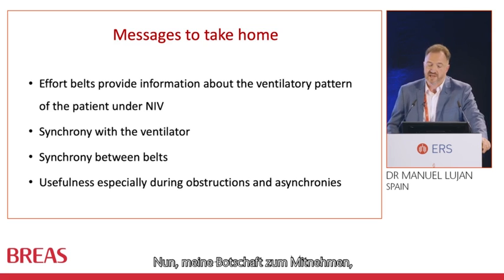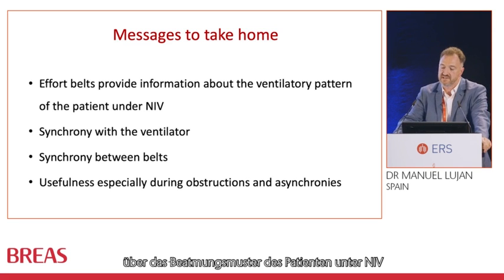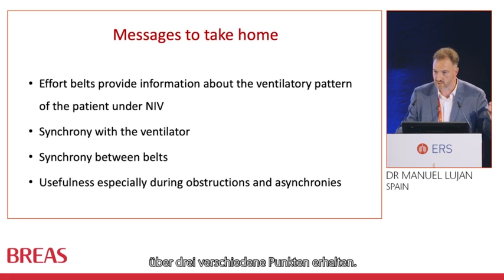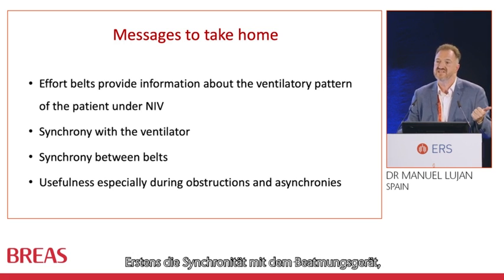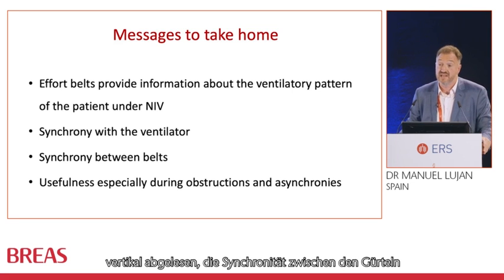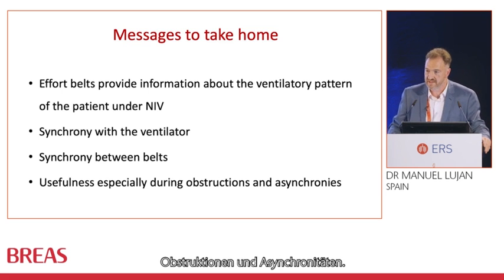Well, my take-home message: effort belts provide information about the ventilatory pattern of the patient under NIV, and we can get information in 3 different points. First, the synchrony with the ventilator, reading in vertical. Second, the synchrony between the belts. And third, the usefulness, especially during obstruction and asynchronies. Thank you very much.